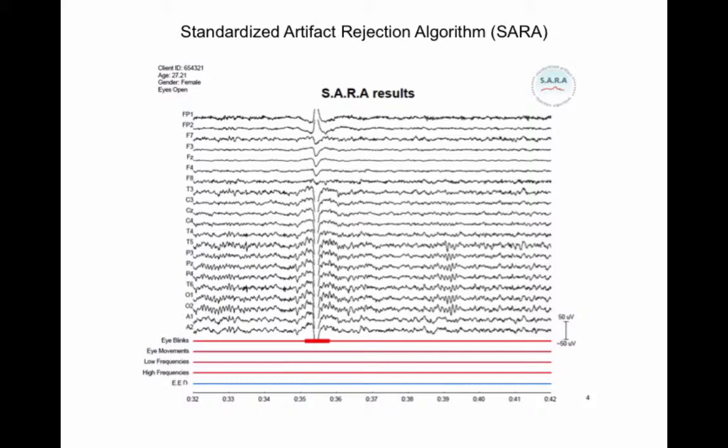The red lines in the bottom of the screen represent the presence or absence of artifacts in these categories. In the current example, the red horizontal bar represents the detection of an eye blink. The EEG of all channels that fall within the duration of that red bar is removed from the raw data.